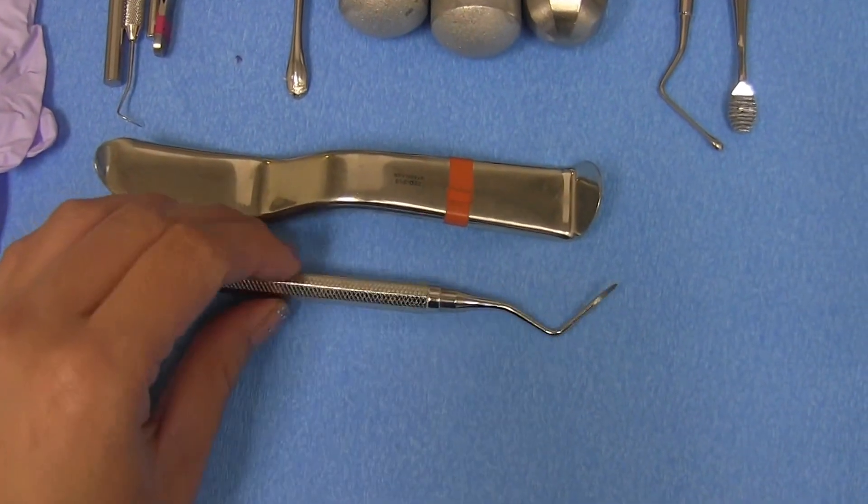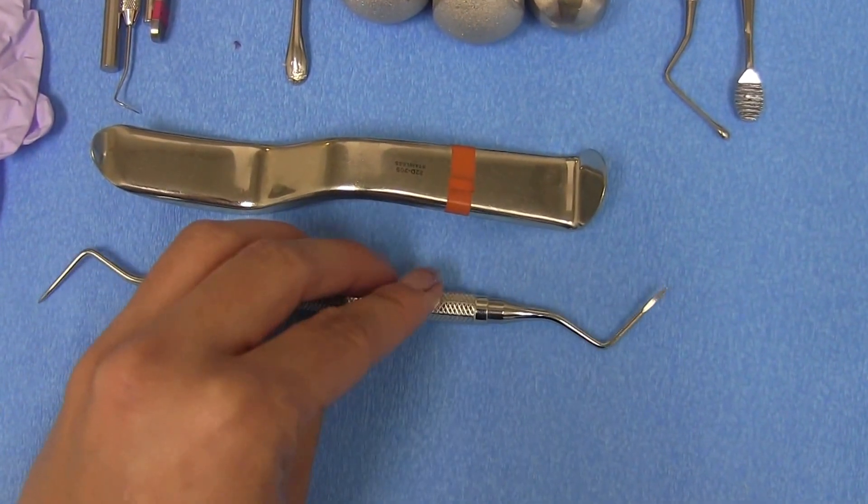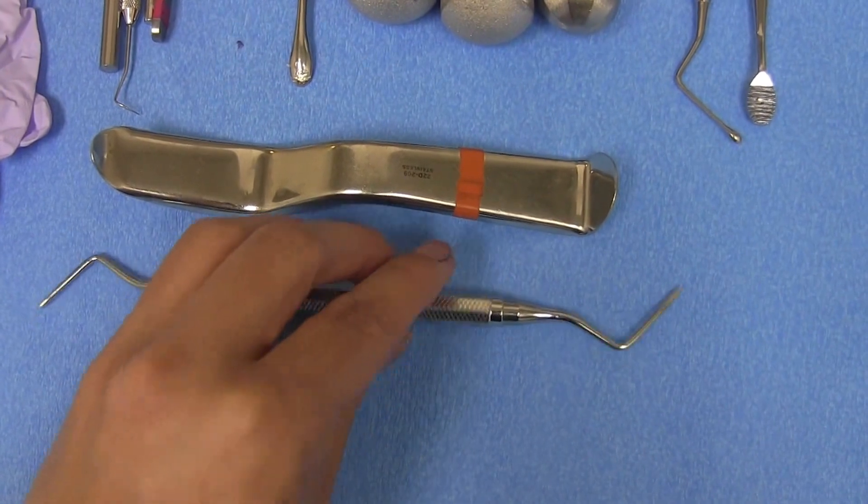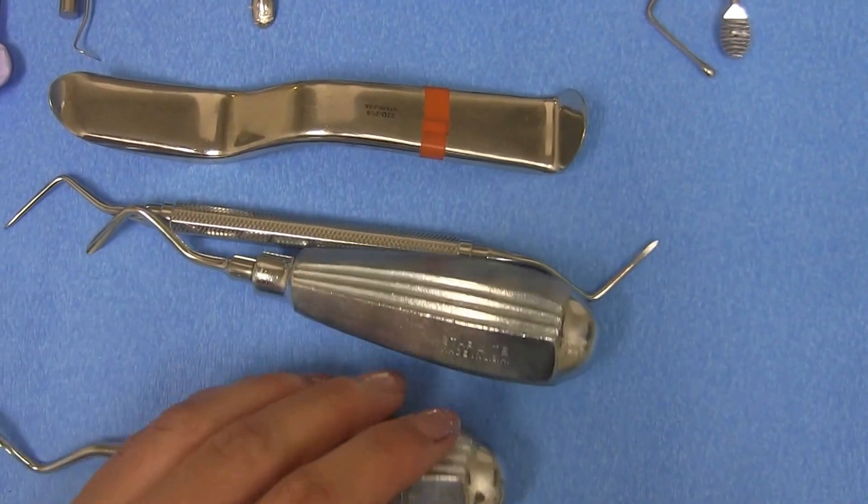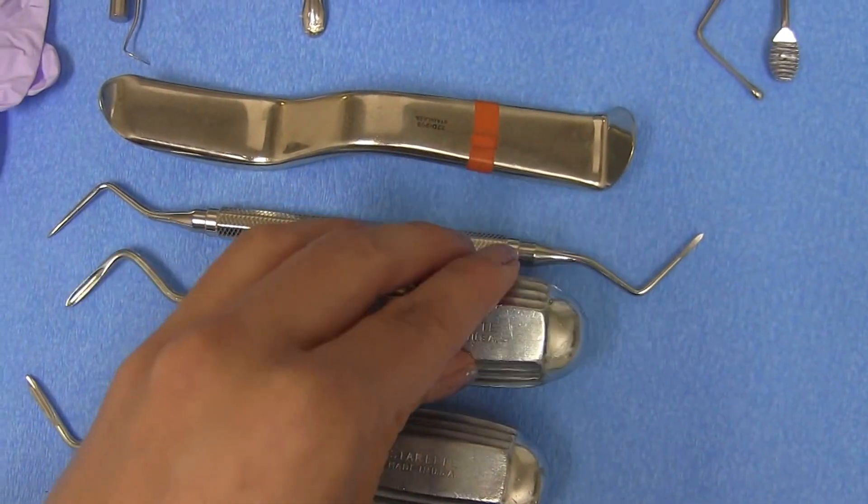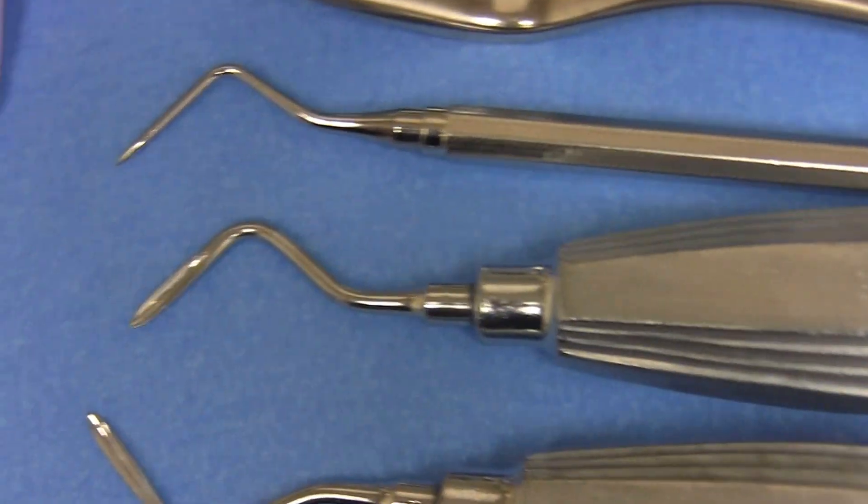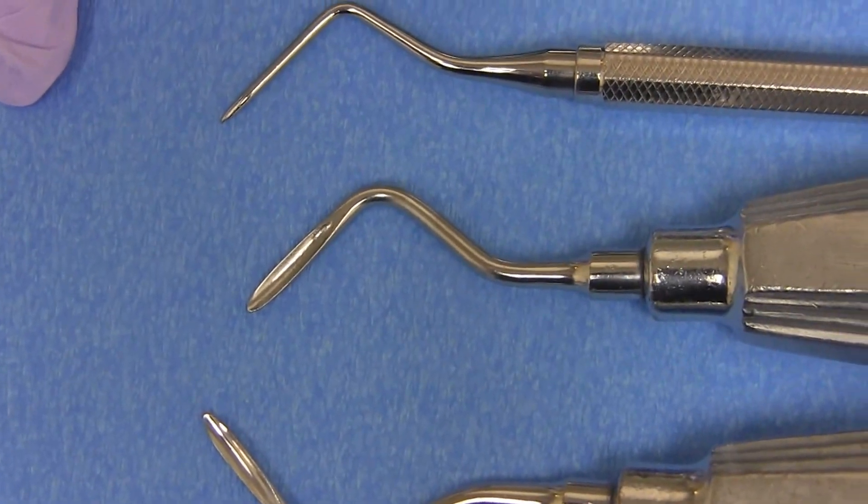This is a skinny root tip, which is double-ended. And then you have your fat root tip picks. And these have pointy ends on them. You can see there.